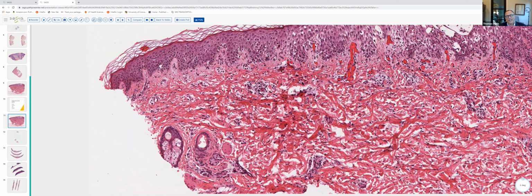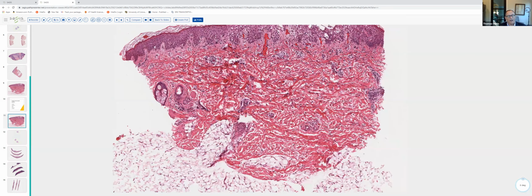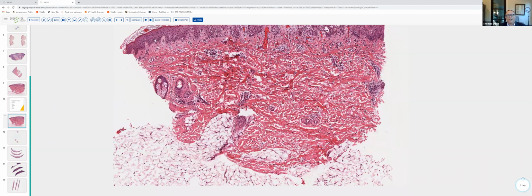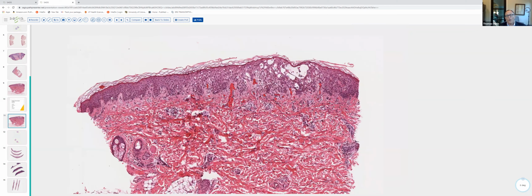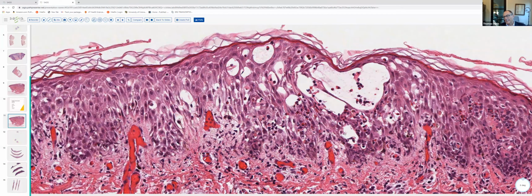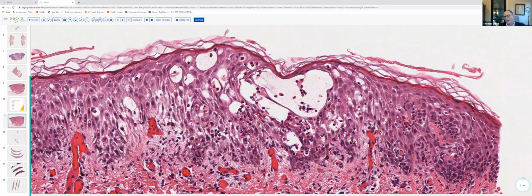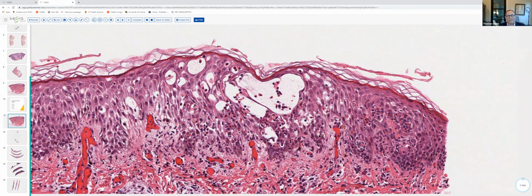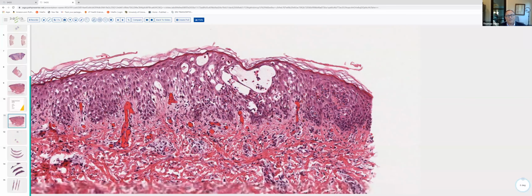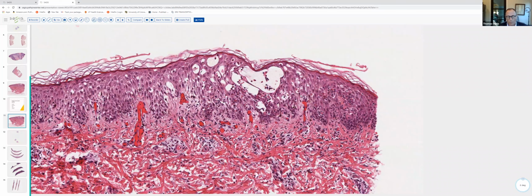There is a slight increase in the number of fibroblasts in the dermis, which is characteristic of young skin, and the adipocytes are somewhat small. Furthermore, when one sees spongiosis with eosinophils in concert with scattered dyskeratotic cells in the epidermis, especially if it's young skin, one really needs to consider Incontinentia pigmenti, the vesicular stage, and that's indeed what this was.